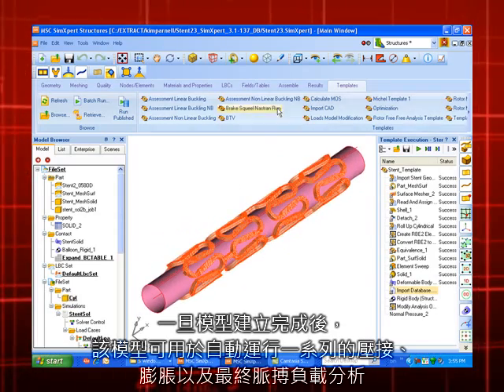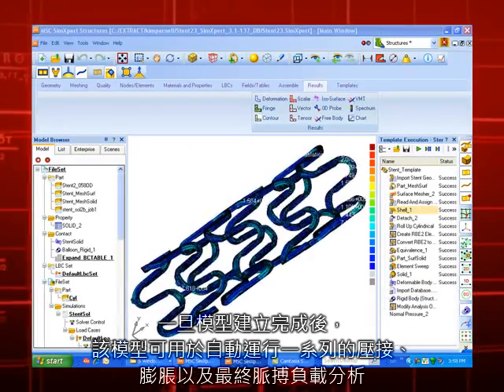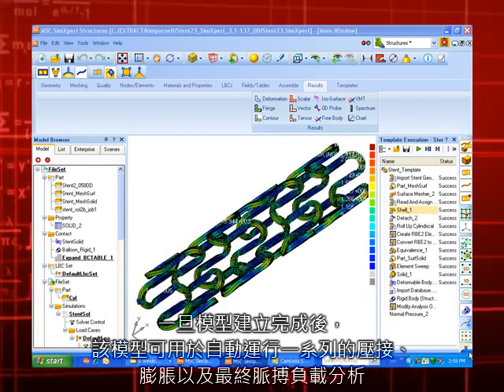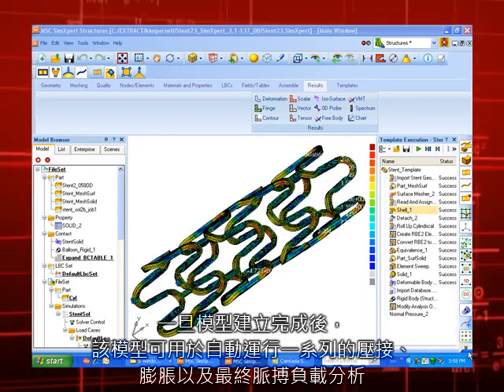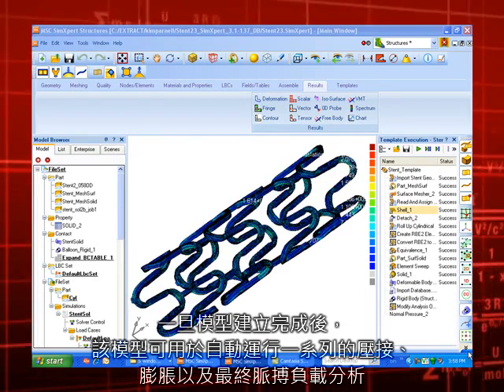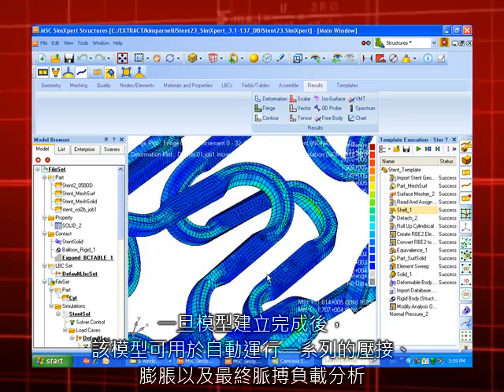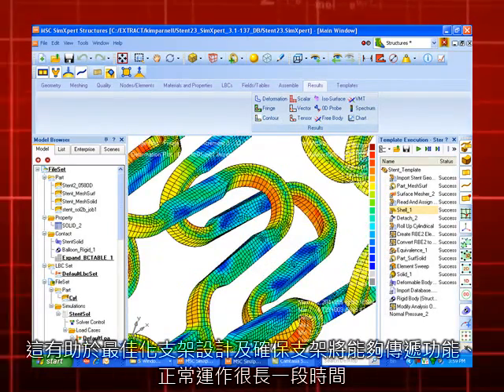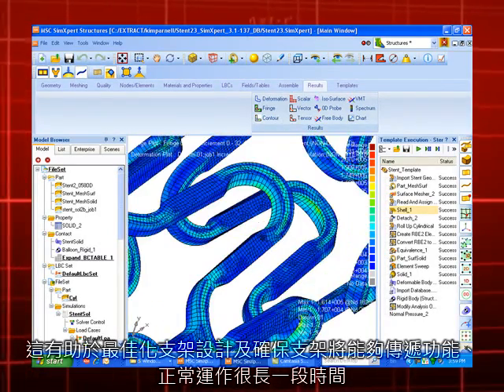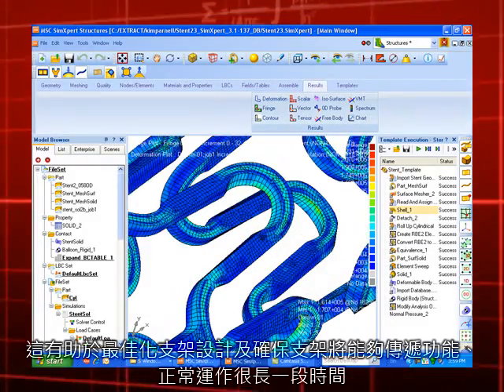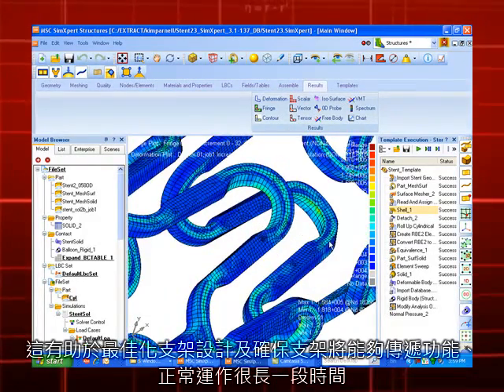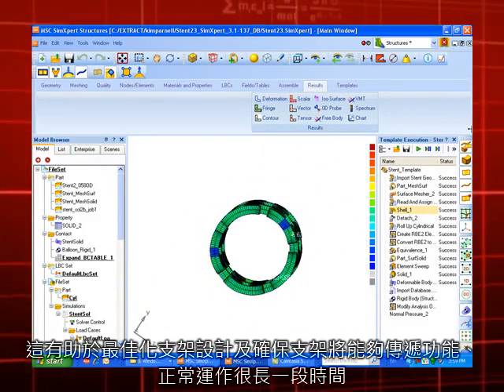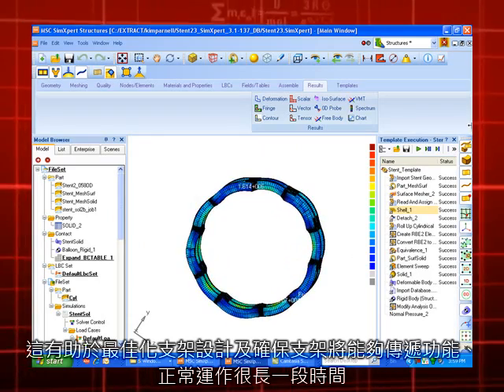Once the model setup is complete, the template is used to automatically run a series of crimping, expansion, and then ultimately pulsation loading analyses. This helps to optimize the stent design and ensure that the stent will be able to be delivered properly and will function for a long time.